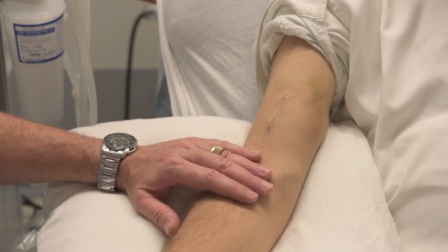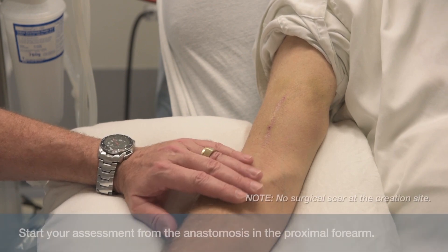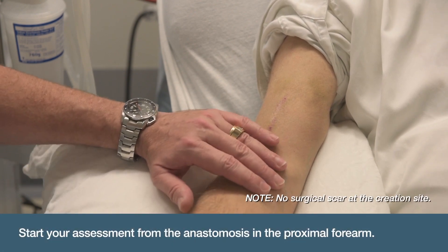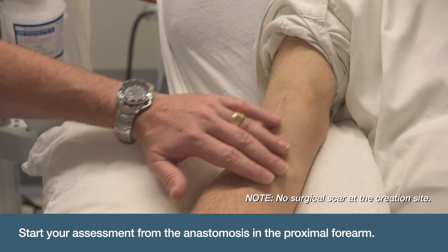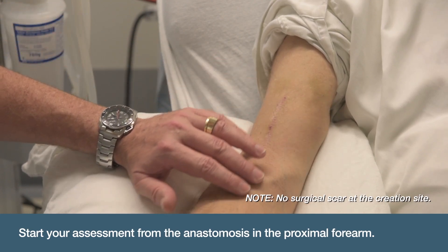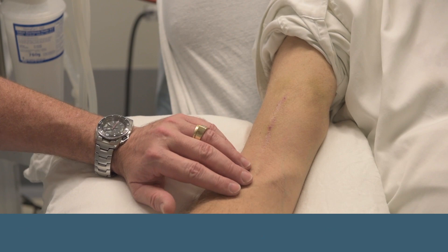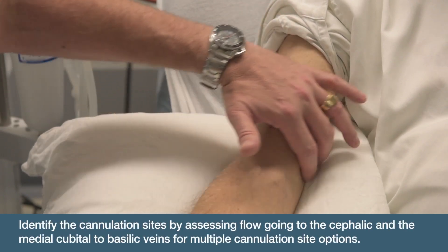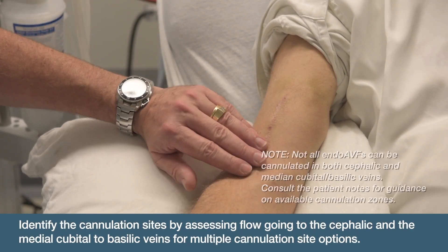Today I'm going to cannulate an endovascular fistula. You can feel a thrill just over the anastomosis. With an endovascular fistula, there's no surgical scar. Because of the configuration, flow actually goes up the cephalic vein and flow will go up the basilic vein as well.